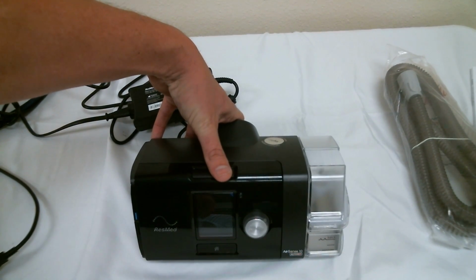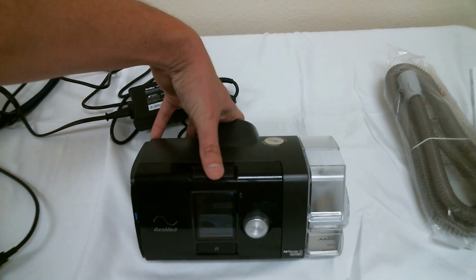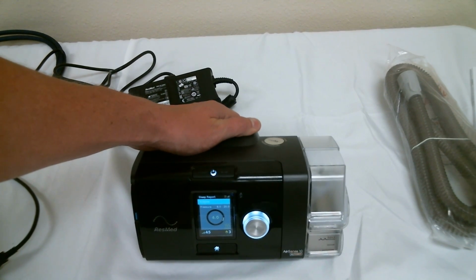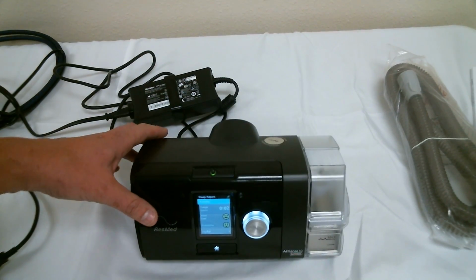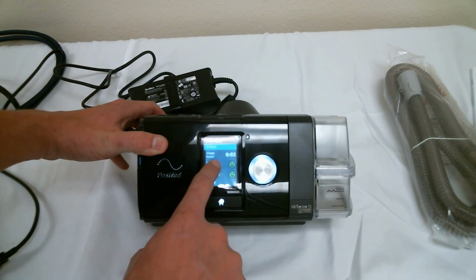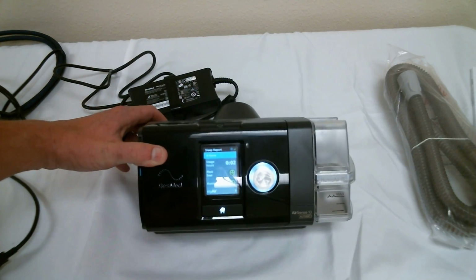The screen will dim quickly so that you're not interfered with while you're trying to fall asleep. Press the knob at any time to wake the machine back up. To power down, press the top button, and you will immediately see a summary of your evening, which will include usage hours, mask seal, and humidifier function.